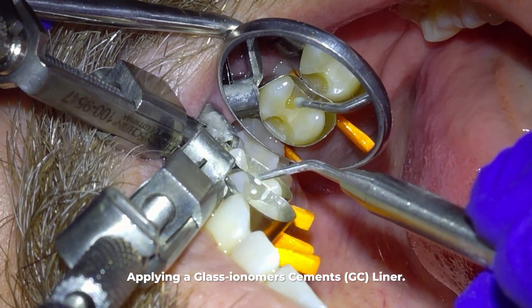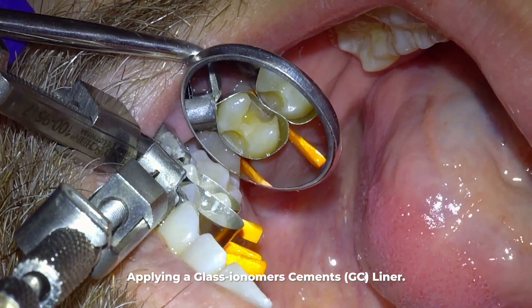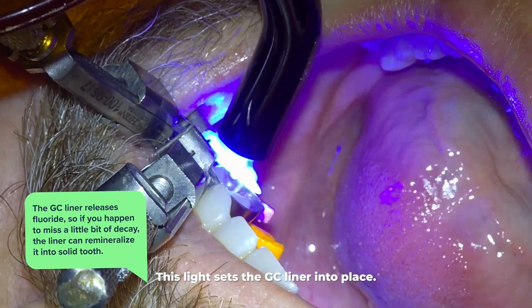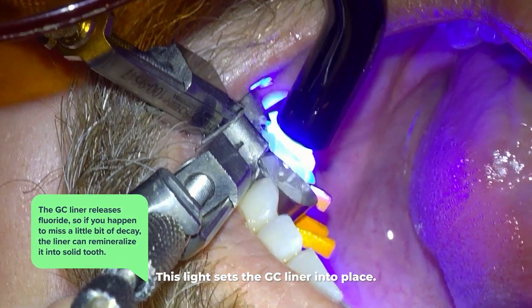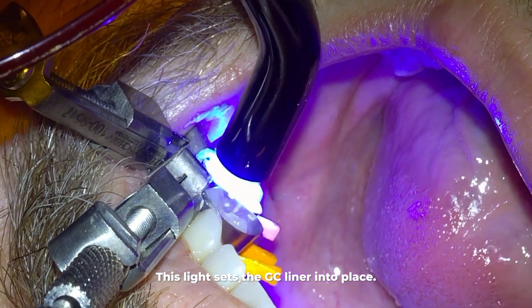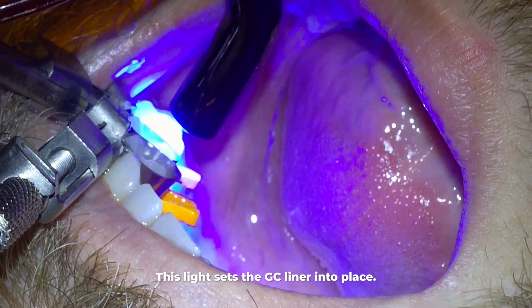Anytime you drill on a tooth, sensitivity is possible due to exposing the dentin layer underneath your enamel. Another benefit of GC liner is that it releases fluoride — so even if you happen to miss a little bit of decay, the liner can remineralize that part of the tooth into solid tooth if it's not a lot of decay left behind. The light I shine on the tooth is what sets that liner into place.